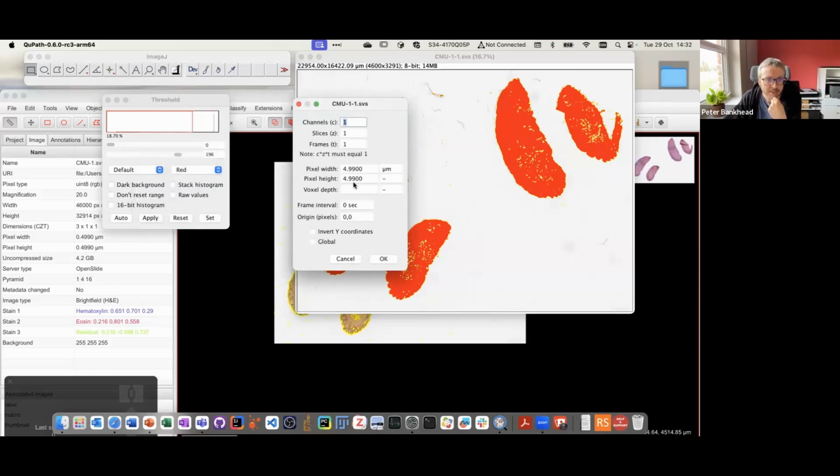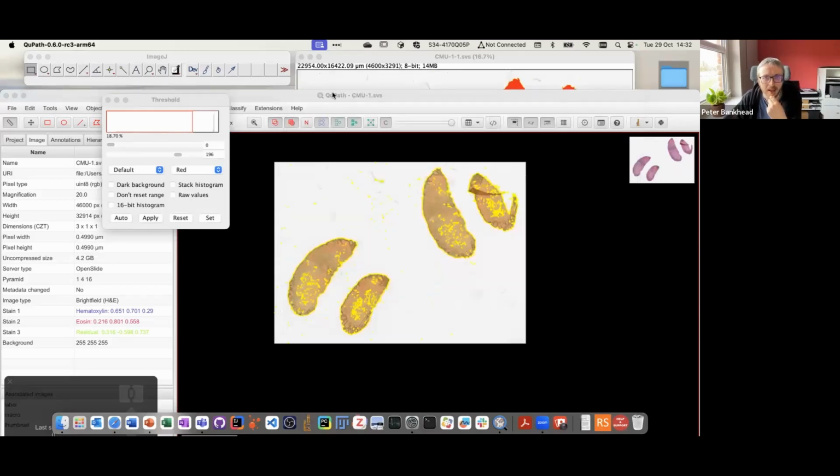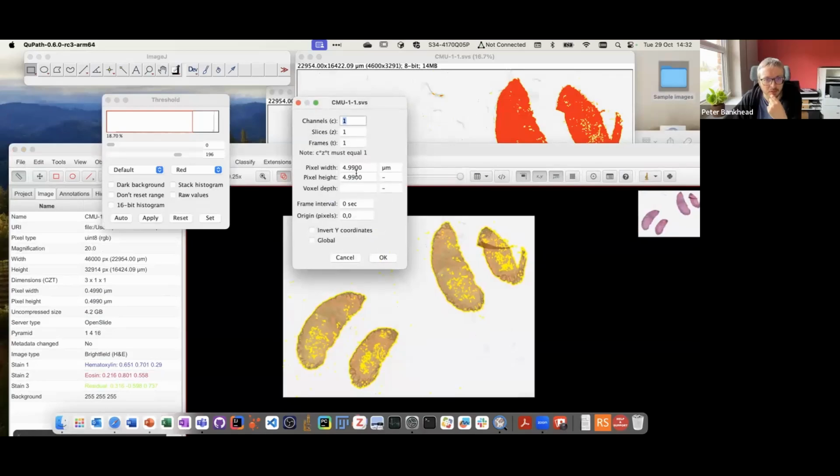It updated the pixel size information, which was previously very close to 0.5 microns per pixel. Once it sends it off at the downsampled resolution, it adjusts these values according to the scale. That's what QuPath uses to figure out how much the image has been rescaled, and that's what allows it to send back the region at the right location.